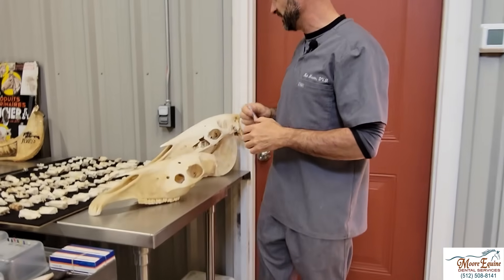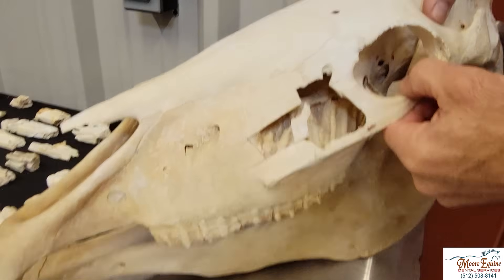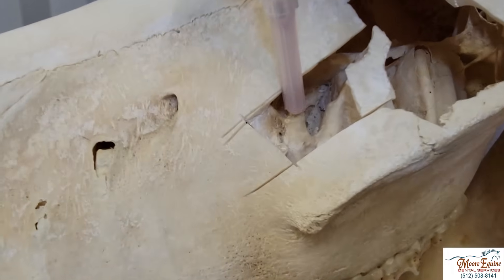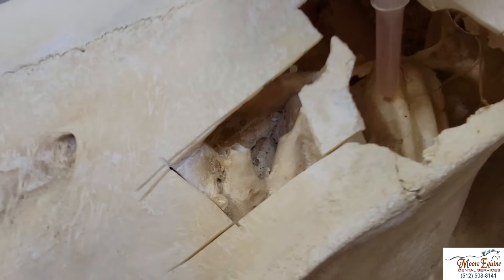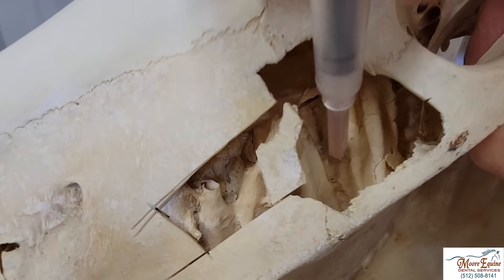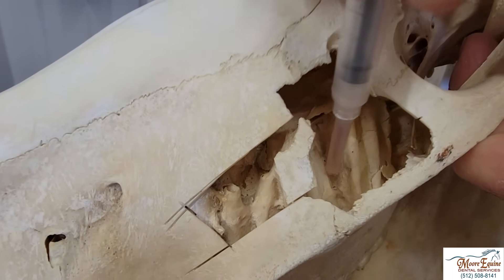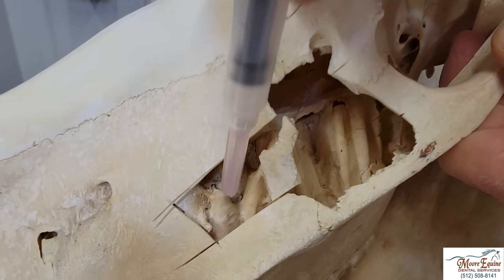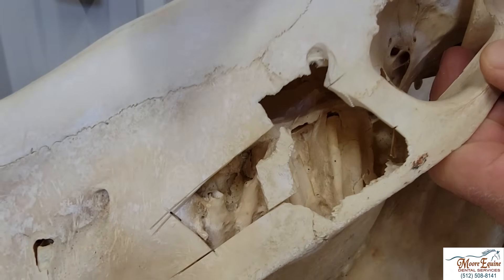Let's look at these skulls. This is actually a tooth root right here where I've got the syringe, and these are also tooth roots. We can see how this compartment is very closely associated with the tooth roots, and the bone that separates it is very thin. So if we have an abscess root right here, it can break into the sinus and then the pus will eventually come out the nostril.